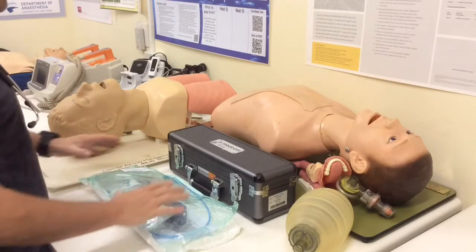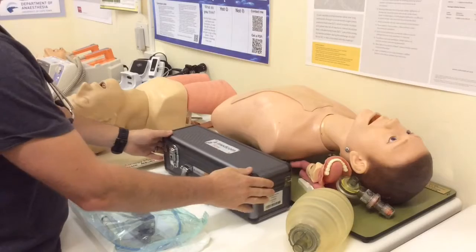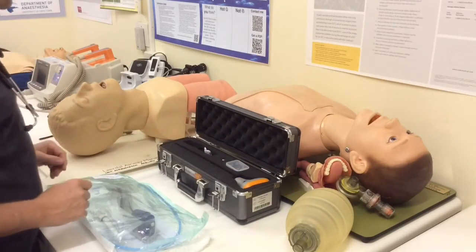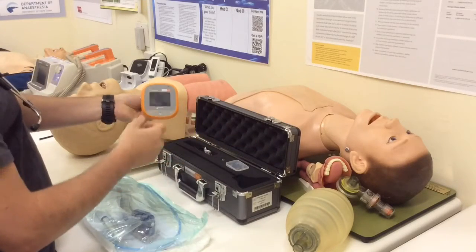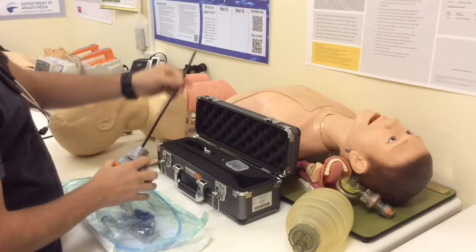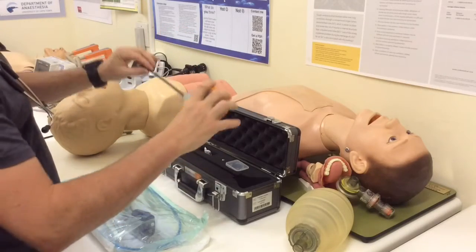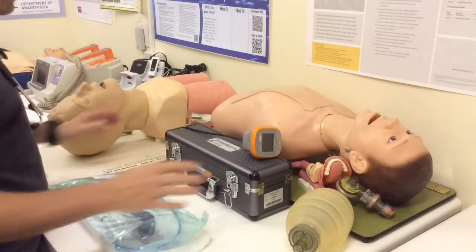It consists of two main parts. There's the disposables, which you get in a blister pack, and there is a reusable camera head which you keep in a nice little box like this. Now the camera head has got a display screen with recording capabilities, a memory card, and then a camera on a stalk. This is a chip-in-tip CMOS camera, and that fits inside the disposable when it's in use. So let's hang on to that for a moment.